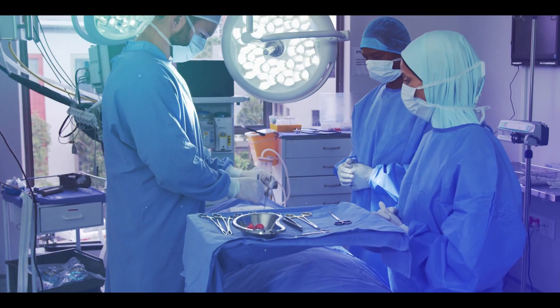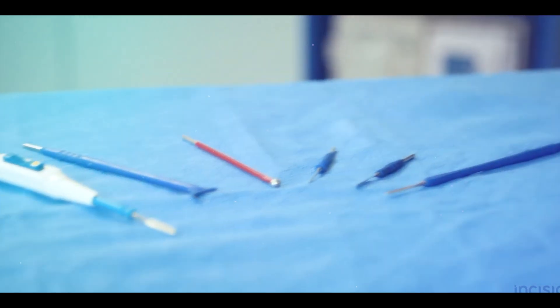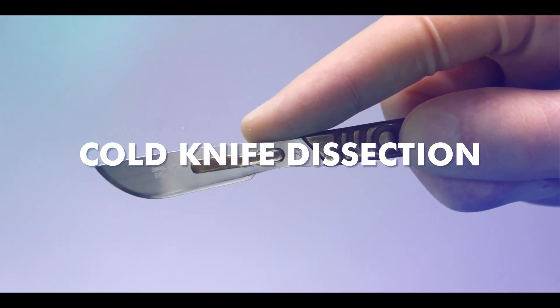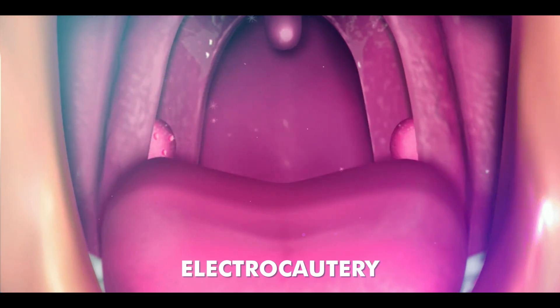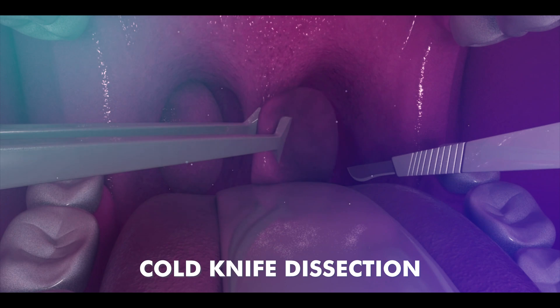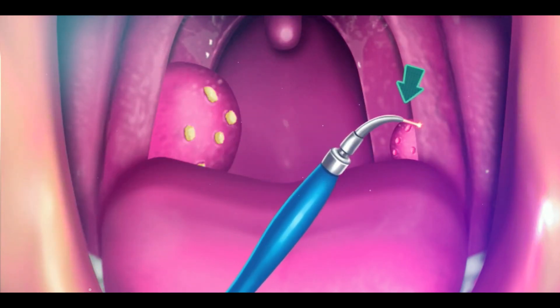During the surgery, patients are put under anesthesia, and tonsils are removed using either electrocautery or cold knife dissection procedures. In electrocautery, the surgeon uses heat to remove the tonsils and stop bleeding, while in cold knife dissection, a surgical knife is used to remove the tonsils, followed by the use of electrocautery to control bleeding.